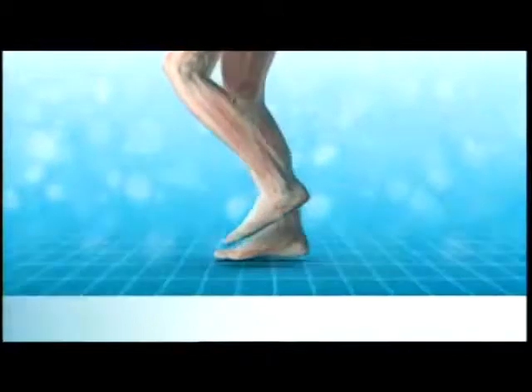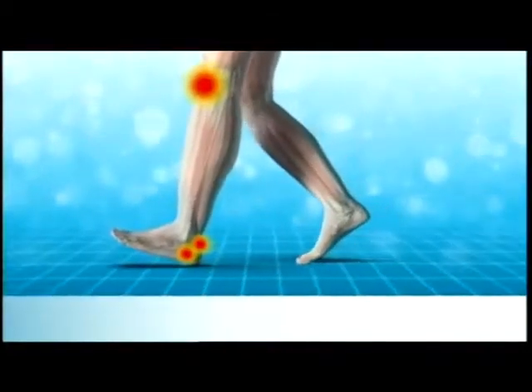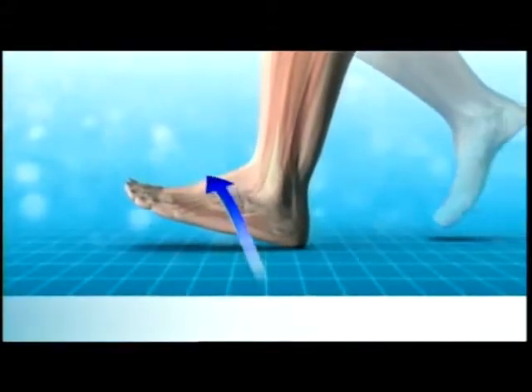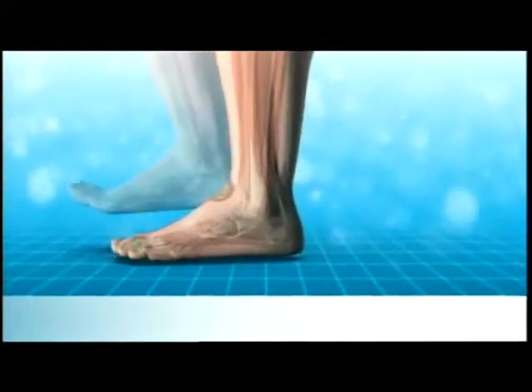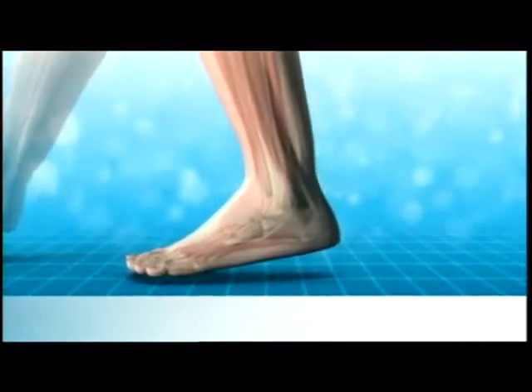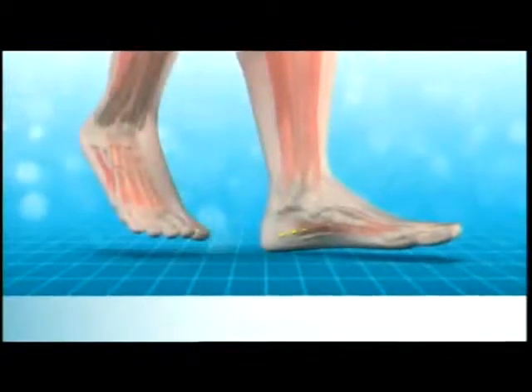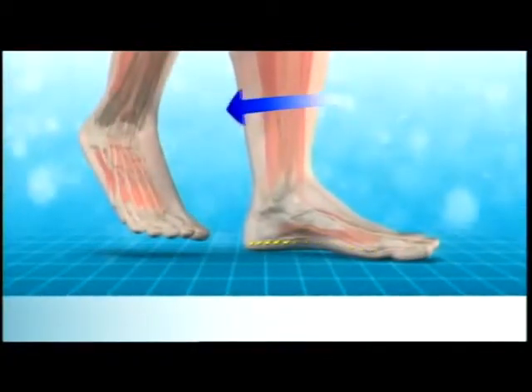When we look at how the forces of walking could lead to common aches and pains, such as pain under the heel, pain at the back of the heel, and knee pain, one movement we are very interested in is called pronation. Pronation is a normal part of walking that happens every time we take a step. It is the movement that occurs during the period from the heel hitting the ground to the foot being flat on the ground. During pronation, the foot rolls over, the height of the arch is lowered, and the leg rotates inwards as the foot moves towards its inside edge.